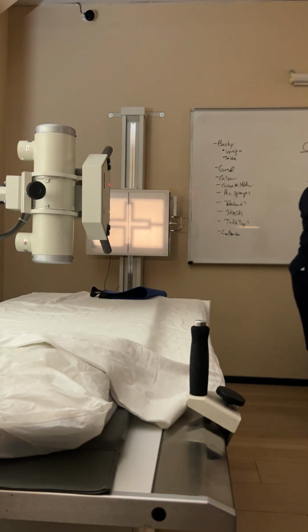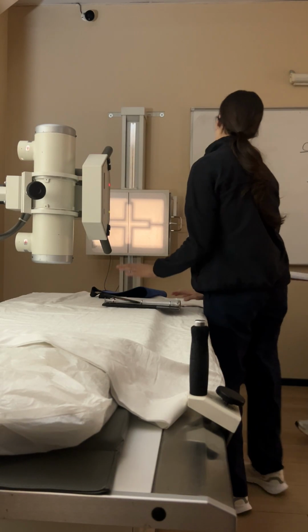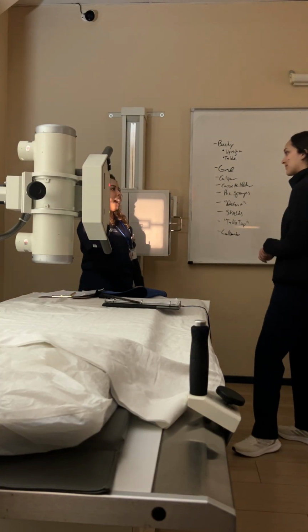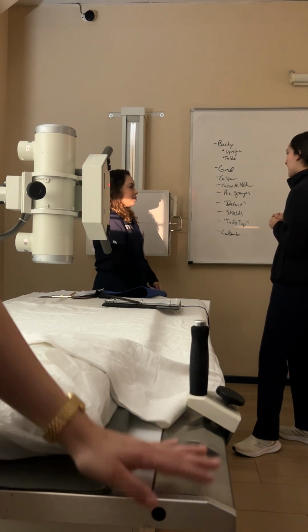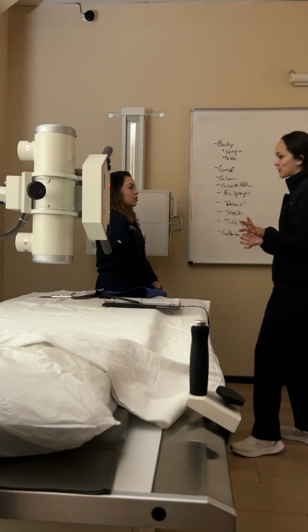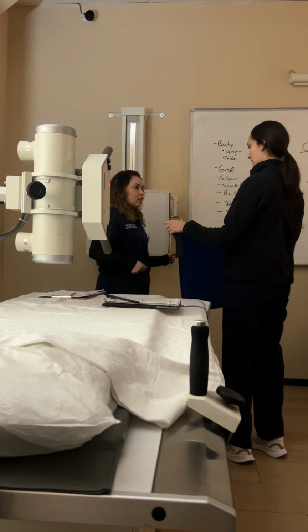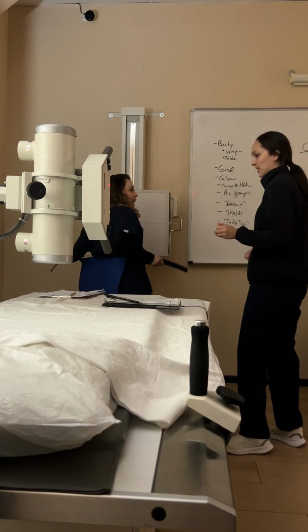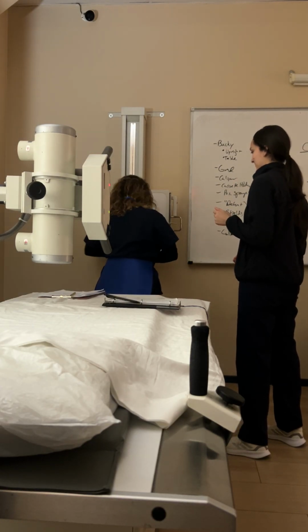So you can instruct the patient on the board, and then there you make the correction, if needed. So what are the main corrections that you check? Sometimes you'll get the patient and they are huge, so then I would change the size, or the height, like you said.